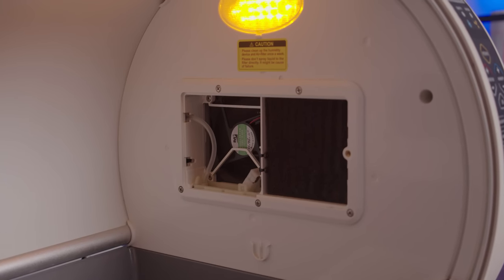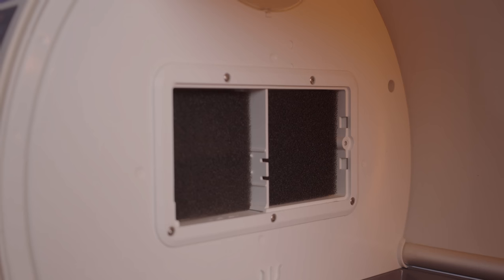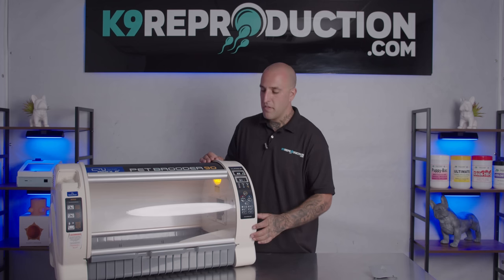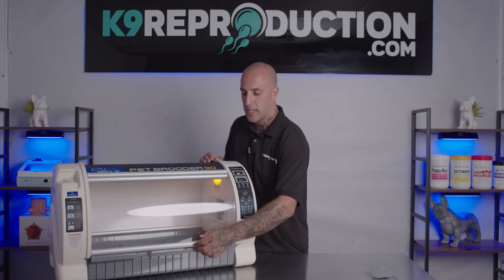The Pet Brooder 90 also comes equipped with air purification which includes three reusable air filters. Another great feature of the Pet Brooder 90 is the easy to use sliding front door.